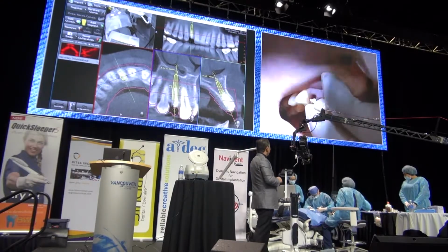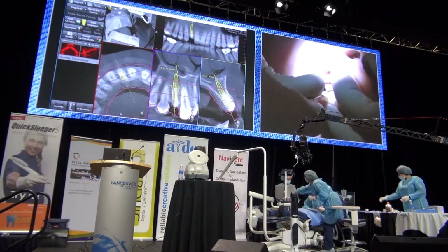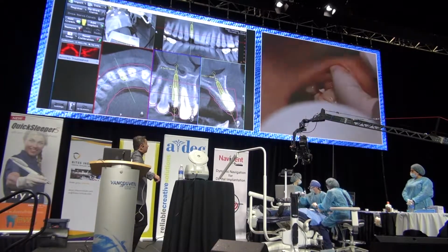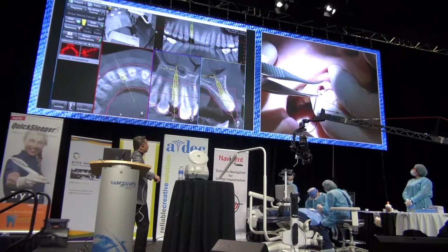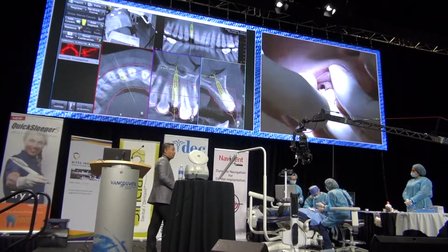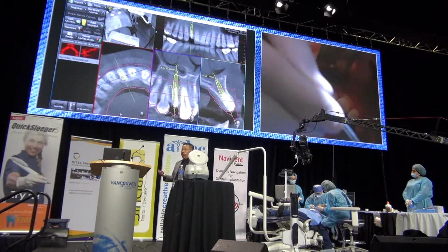So we're using an internal engaged implant system, and Dr. Kwan has beveled the palatal aspect. So again, that's where the screw access hole is going to come out of. And again, we have our choices of using screw retain versus cement retain provisional. Let me say, as a prosthodontist, always go with screw retain, because you want to have that flexibility of retrieving and or taking it in and out.